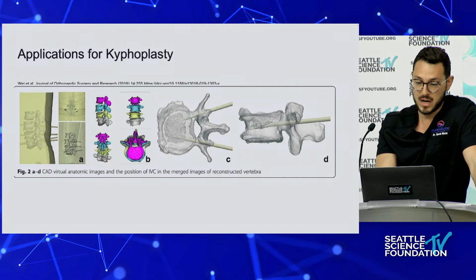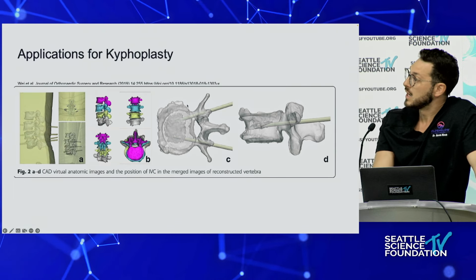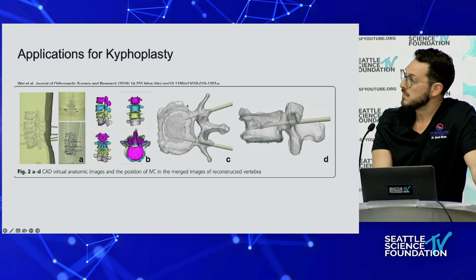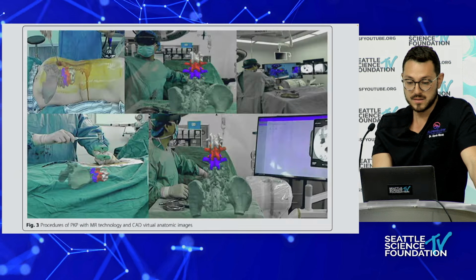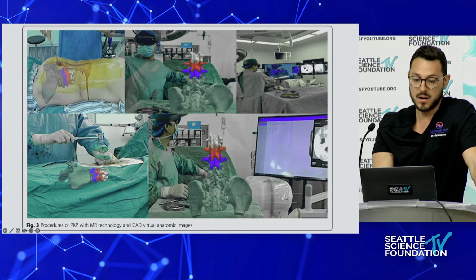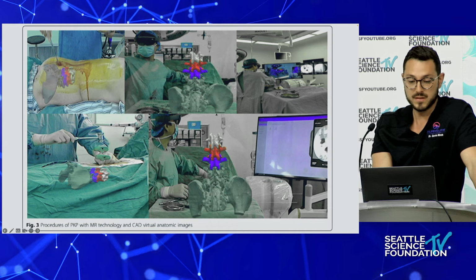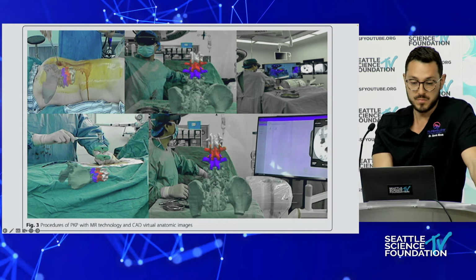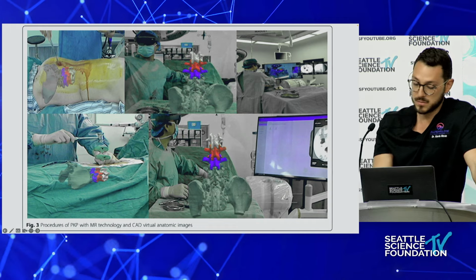and we'll be able to do some of this in lab as well. The applications for kyphoplasty, this is a study that was done at a hospital in China. It was a 3-level kyphoplasty where they essentially just did the pre-procedural planning, where they had their trajectories planned before going into the case. They used the Microsoft HoloLens, and during the case of the procedure, they were confirming with the C-arm, but this was kind of the first proof of concept of how can we do these procedures with visualizing the anatomy overlaid on the patient while we're doing the procedure.